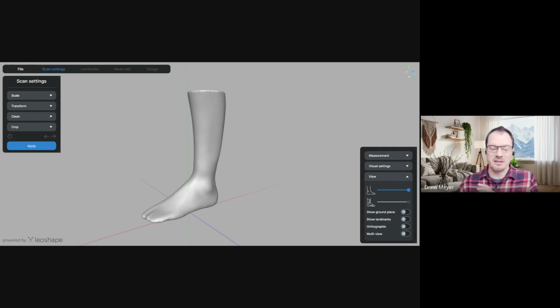One of the interesting things that I've seen is some people are starting to say, I used to CNC mill, but now I can actually FDM print my rectified positive model. That's a really interesting use case that we're seeing more and more of, people using the positive model export in a printing configuration.